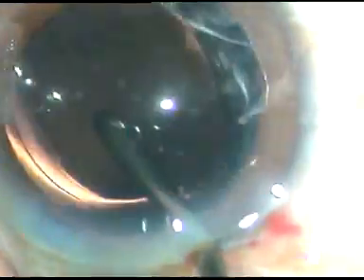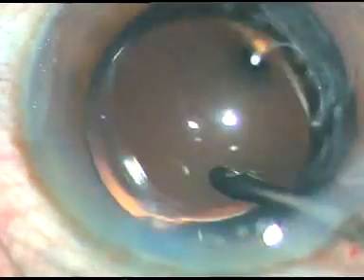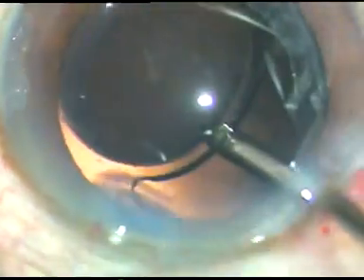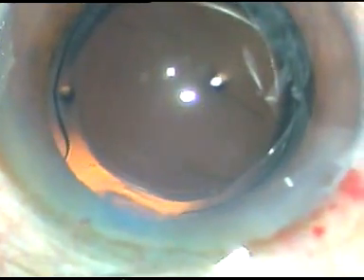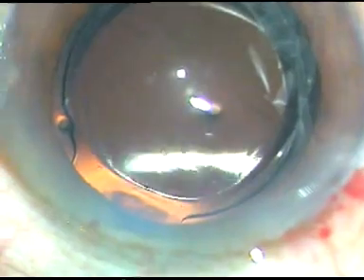And this is the intraocular lens — it has gone into the capsular bag. The lens is now placed nicely in the bag.